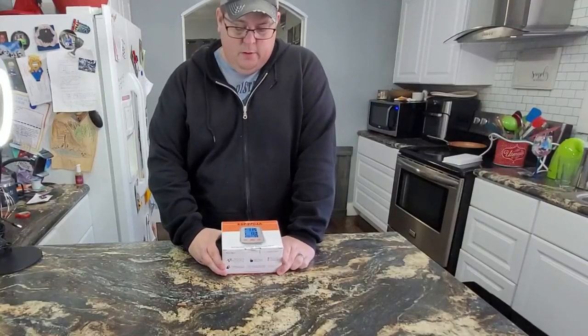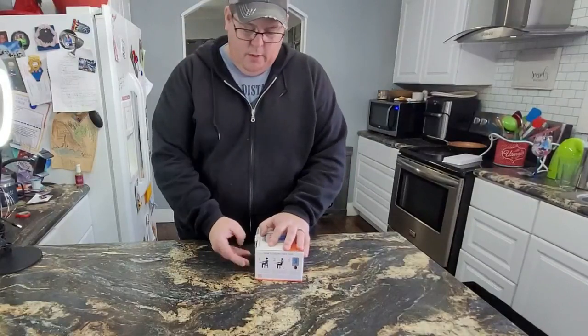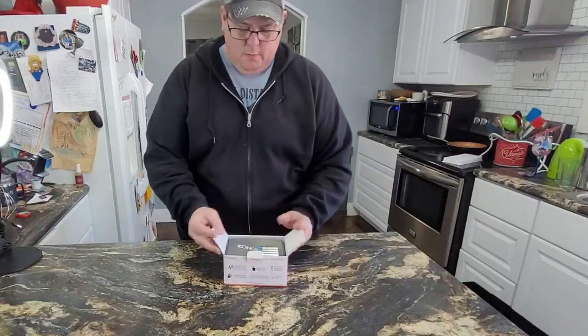We're going to unbox this digital automatic blood pressure monitor. It's already taking the liberty of pulling the tape off. Let's just see what's in it and what it comes with.